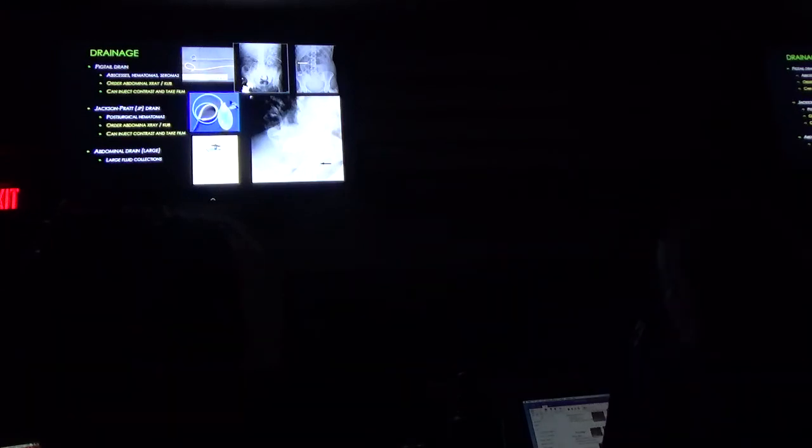This is actually a picture of a renal catheter, nephrostomy. So like your dialysis patients or patients that are in complete renal failure, they literally have that catheter to drain the kidney, because there's no kidney function whatsoever. And again, that's done by interventional radiologists.